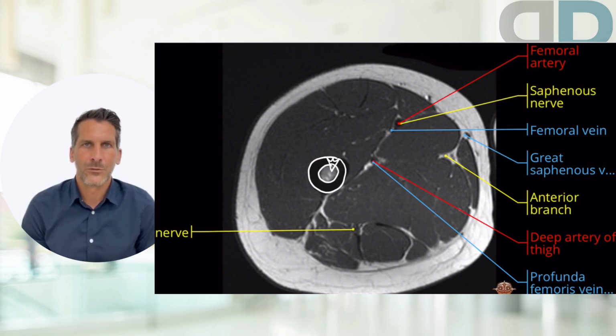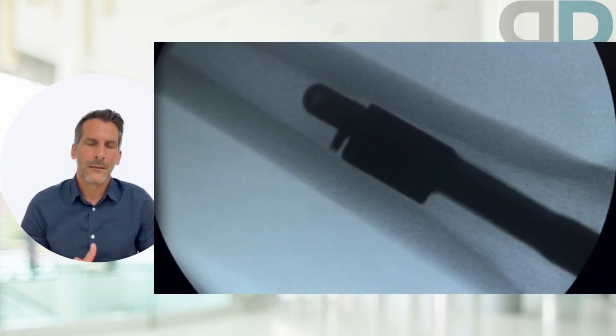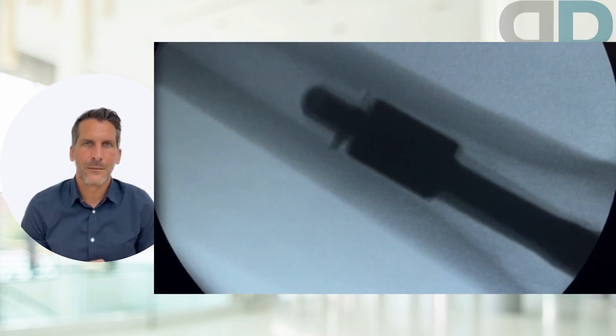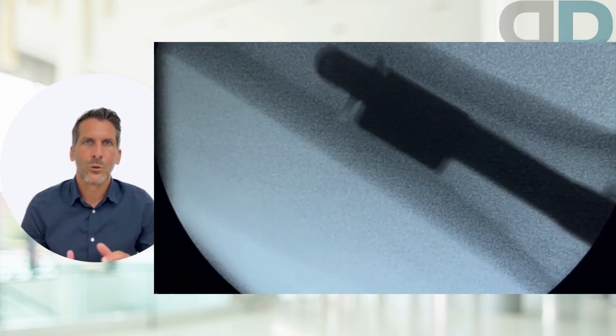Since the femur is often elliptical, small bone bridges usually remain, which can then be easily severed with the vibrating saw. I will show you this with an example video. You see the femur at its upper end. The gray area of the tube is the medullary cavity. The dark edges represent the bony wall.